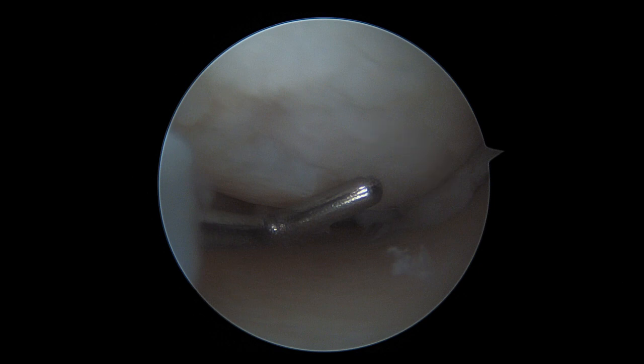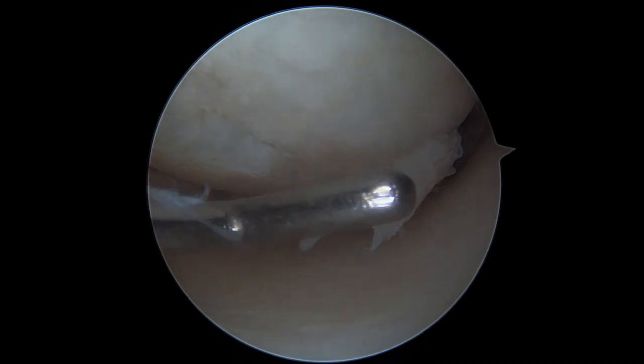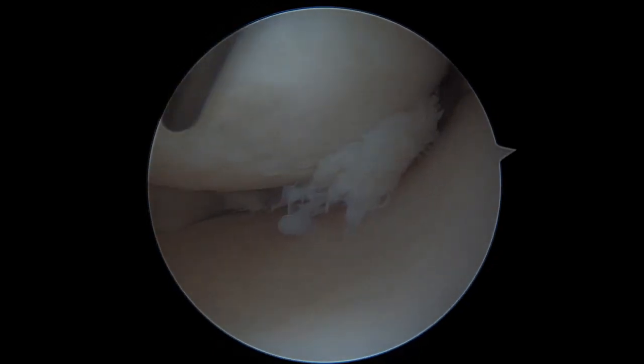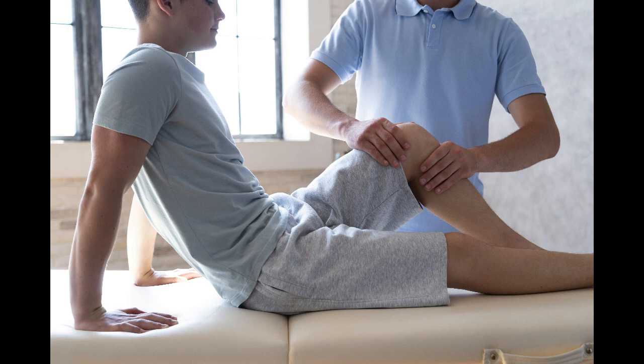Furthermore, we'll have the opportunity to analyze in detail the classification in grades of the chondropathies in some dedicated video, but now what we see at this level is a mild chondropathy, and in this previous context we may assess the presence of a degenerative tear of the posterior horn of the medial meniscus that presents a flat and unstable segment that goes making an impingement between the femur and the tibia, the posterior region of the knee, and may provoke not only painful symptomatology, but also occasional joint blocking with a painful limitation of the last grades of range of motion, both in extension or in flexion.